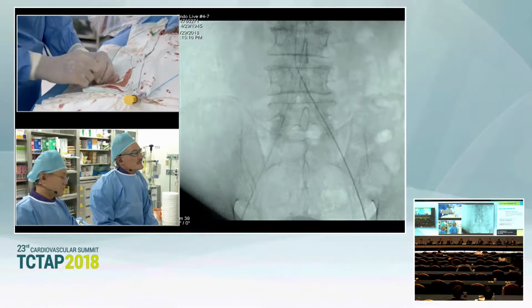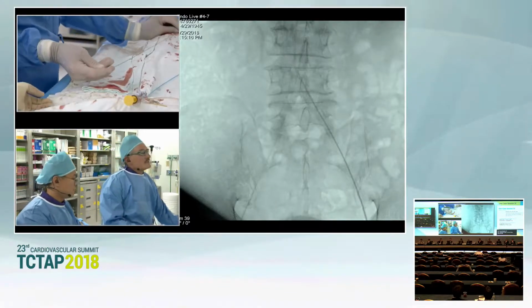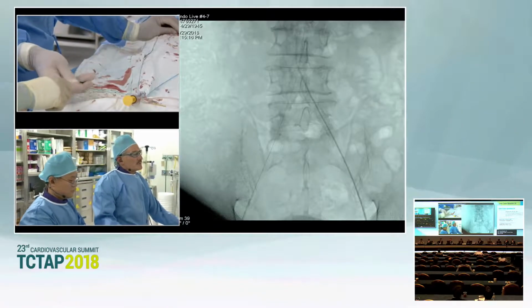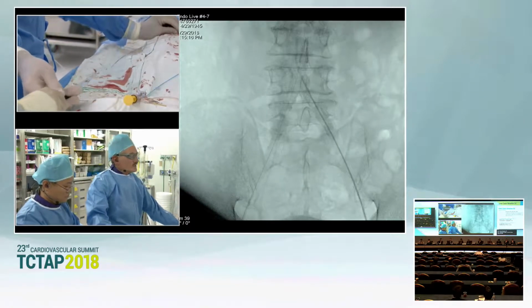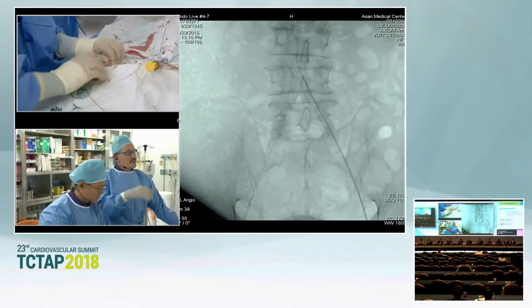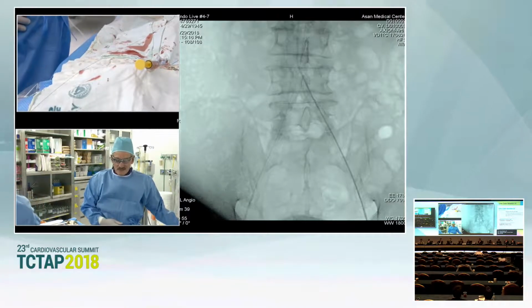It followed really nicely. You can see it's following the calcium channel the whole way. I feel pretty comfortable now to do a small balloon pre-dilation. I had very good blood return, easy, just aspirating the CXI after crossing.